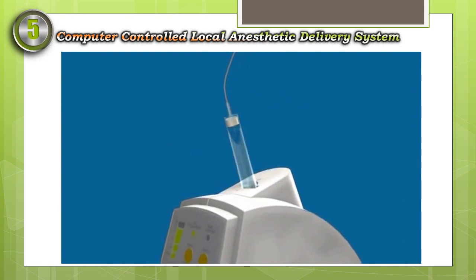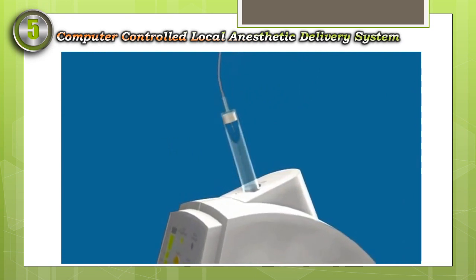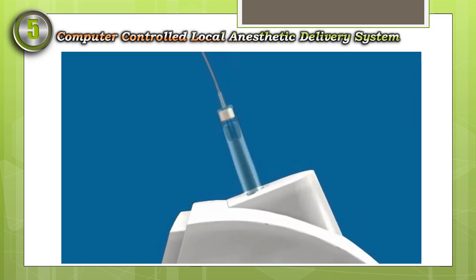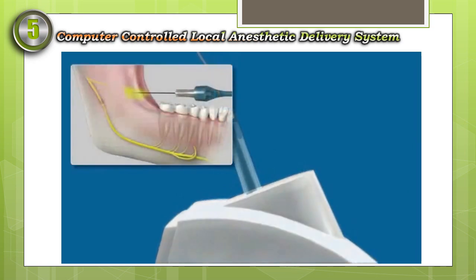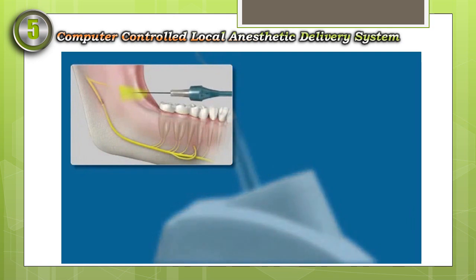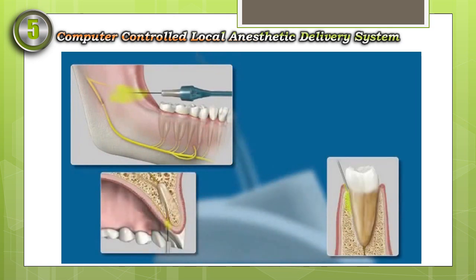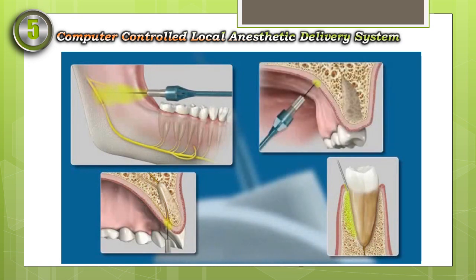provides technological advantage to this delivery system for dental injections, resulting in a safer, accurate, and more comfortable dental injection for the patient. C-CLAD systems can be used to perform all the current dental injection techniques currently taught and may also allow practitioners to more effectively perform some of the newer dental injection techniques developed with C-CLAD systems, like the AMSA, PASA, and STA intraligamentary injection.